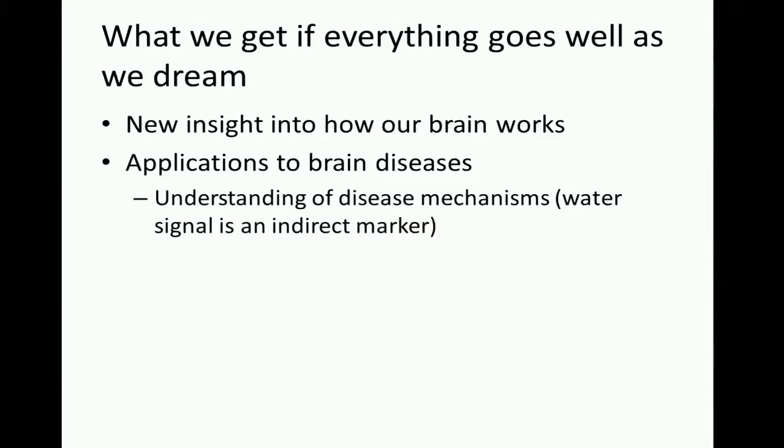Understanding the disease mechanism is a really nice goal. Although MRI, regular MRI, is just detecting signal from water, so it's very difficult to get very direct evidence at the cellular level, molecular level, gene level.